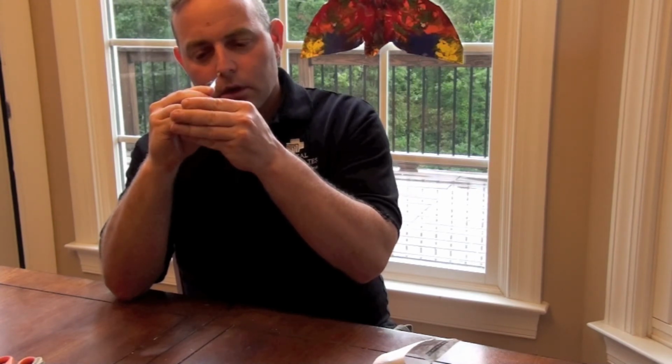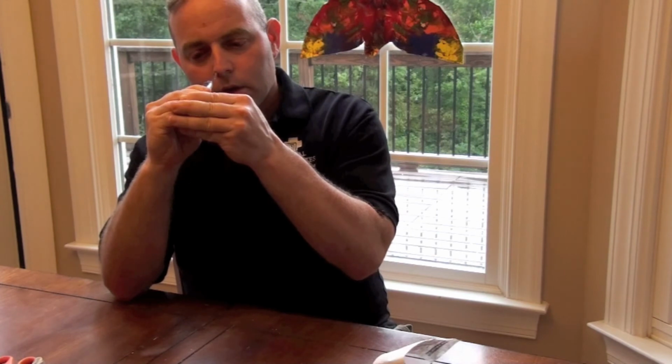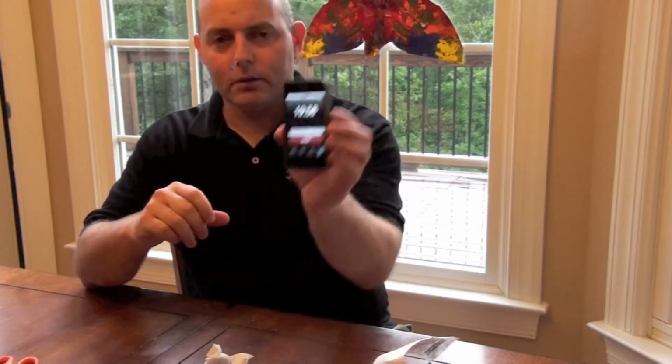You can feel the lidocaine. It'll drip down the throat a little bit. There we go, and just be gentle with it. It feels like a lot more than 2 cc's when it hits your throat. Okay. Start the timer. And go. So I've got 20 minutes on the clock. I've got this properly seated.